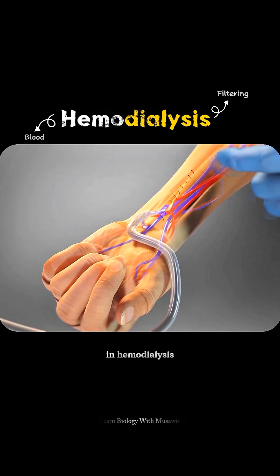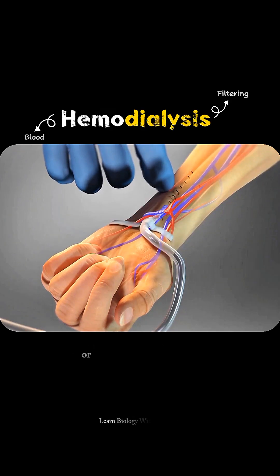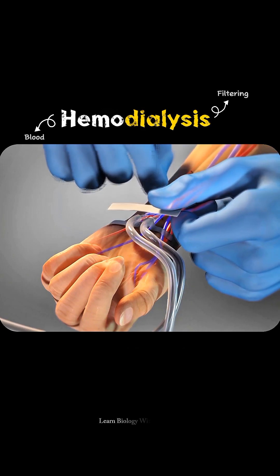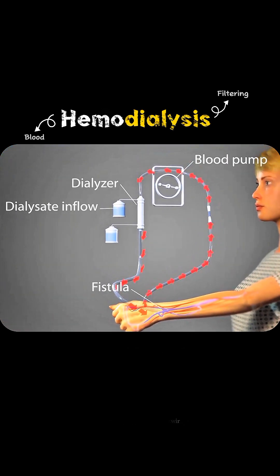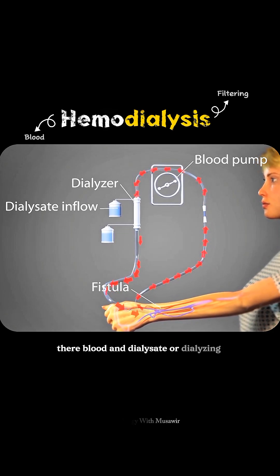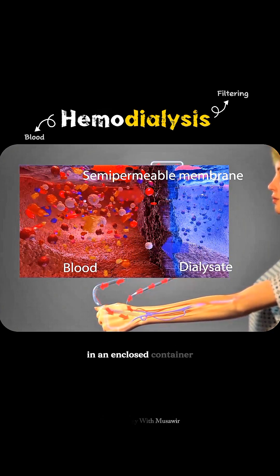In hemodialysis, blood is pumped out of the artery, through the fistula or graft, and into a dialyzer. There, blood and dialysate, or dialyzing solution, flow across a semi-permeable membrane in an enclosed container.